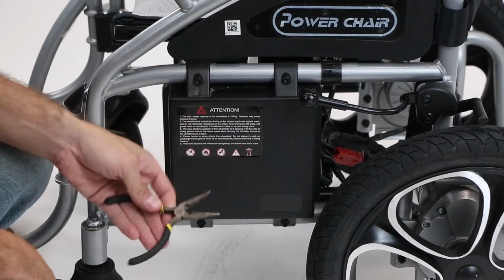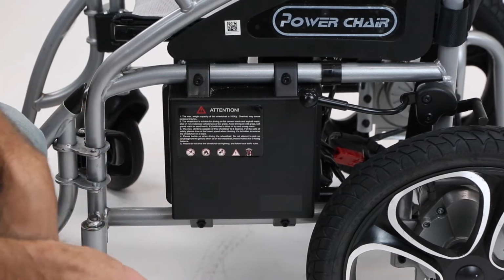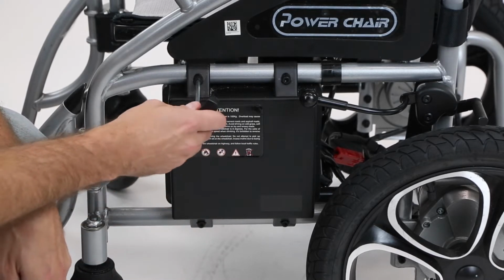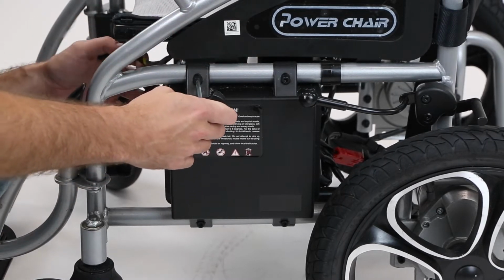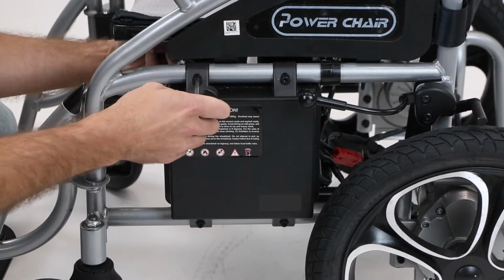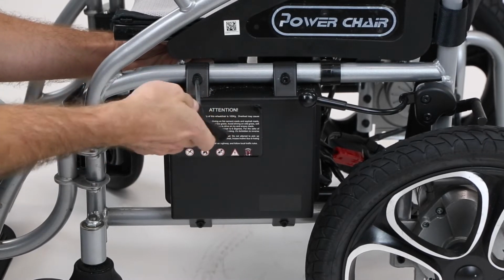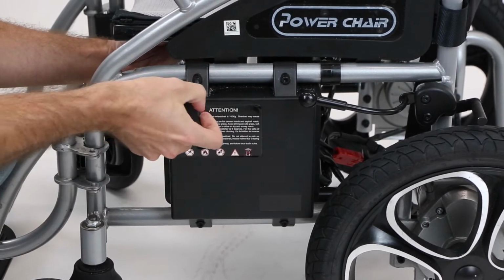And you're going to need either a wrench or a set of pliers like I'm going to use, and then a 3/8 inch Allen key. So you're just going to take your Allen key and insert it like so, and then take your wrench, and on the other side there is a small bolt that you will just have to clamp onto, like so, and then you will just begin to remove each one of the bolts one by one.